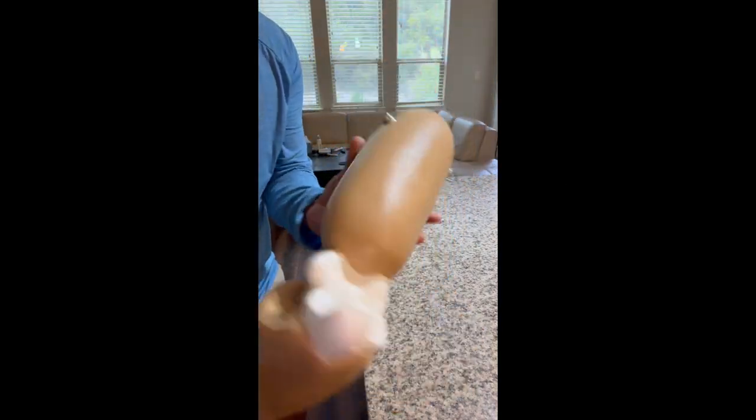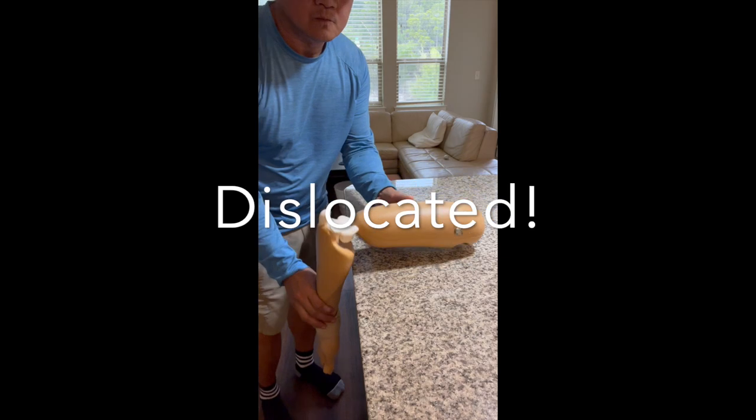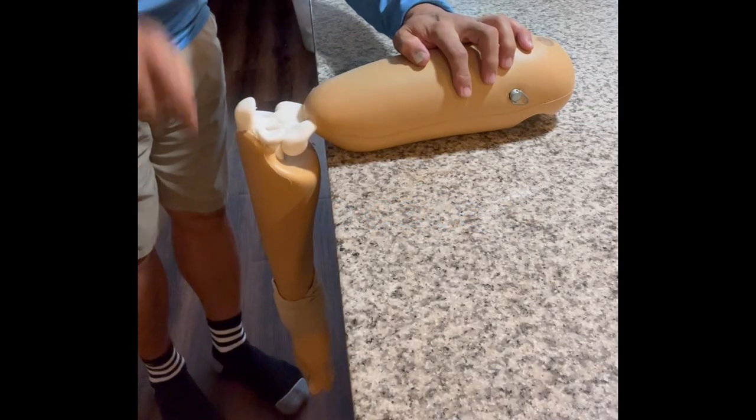And finally, the finger dislocation simulator. Practicing with this tool gives you control and precision for that satisfying pop back into place.